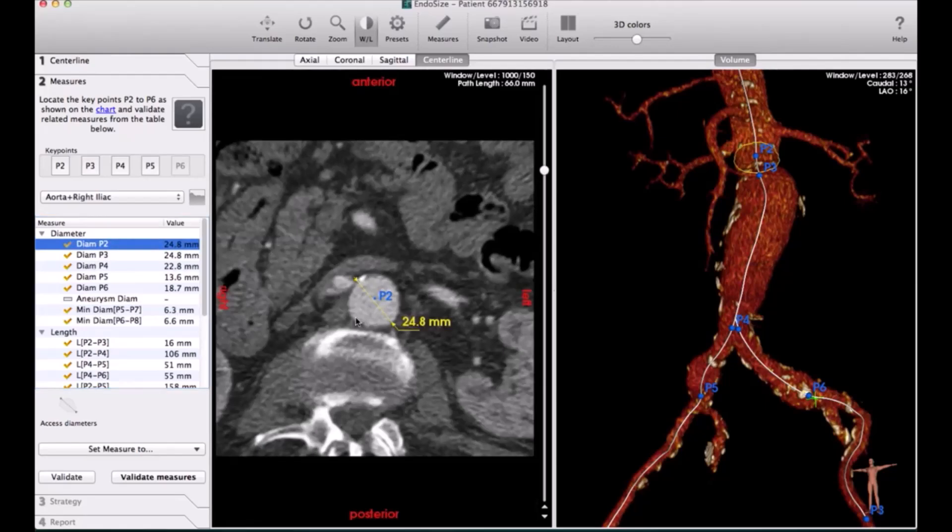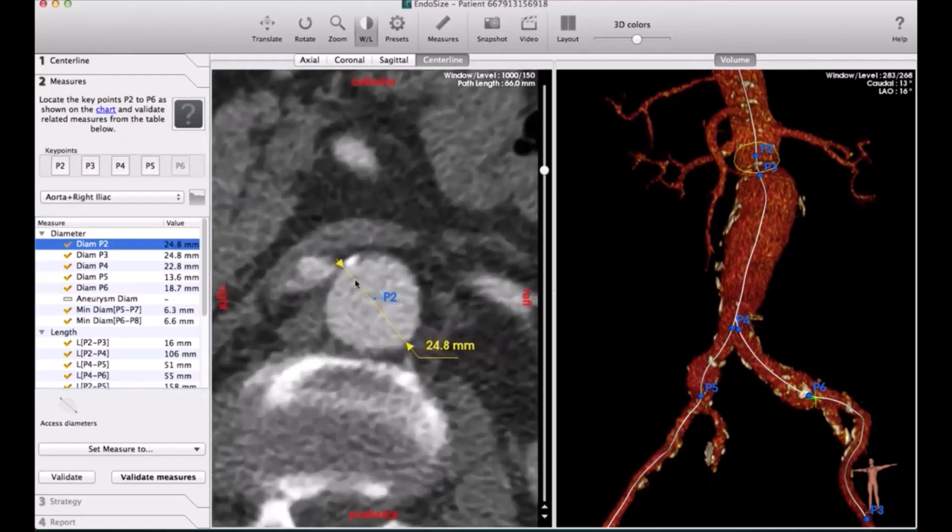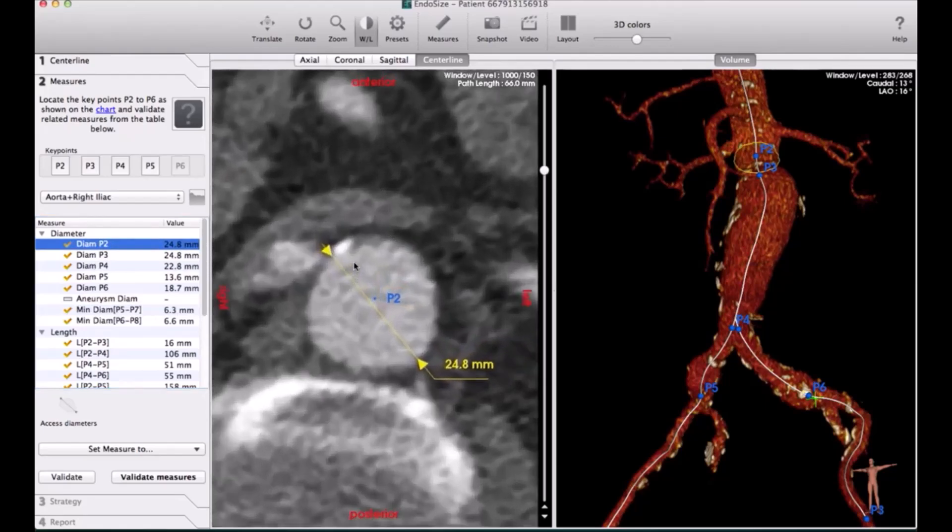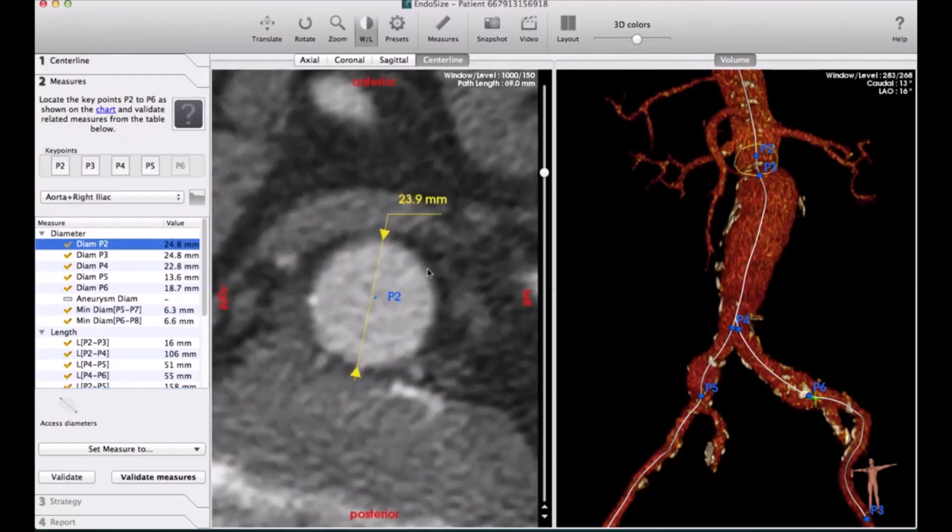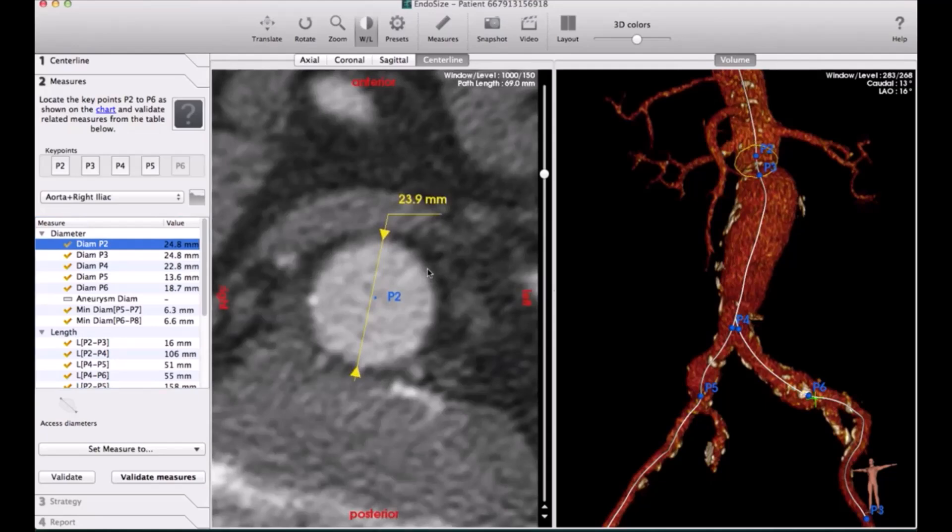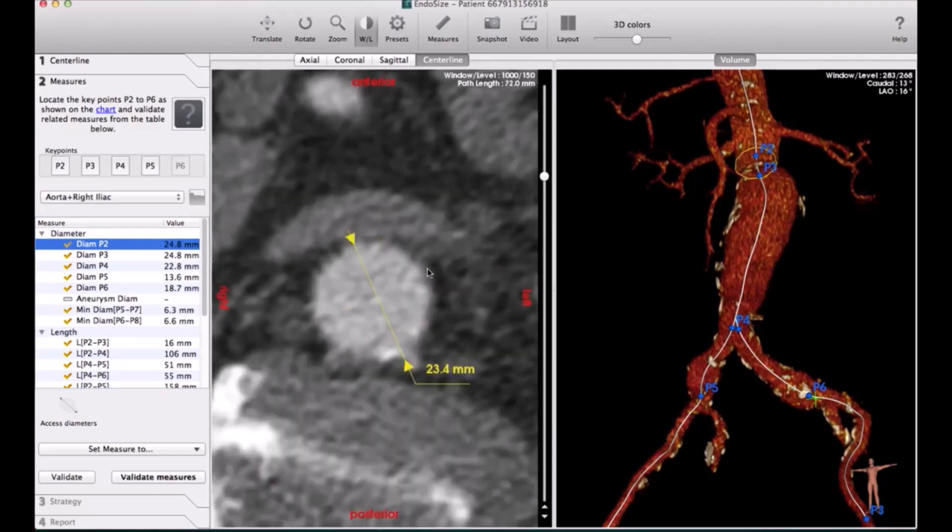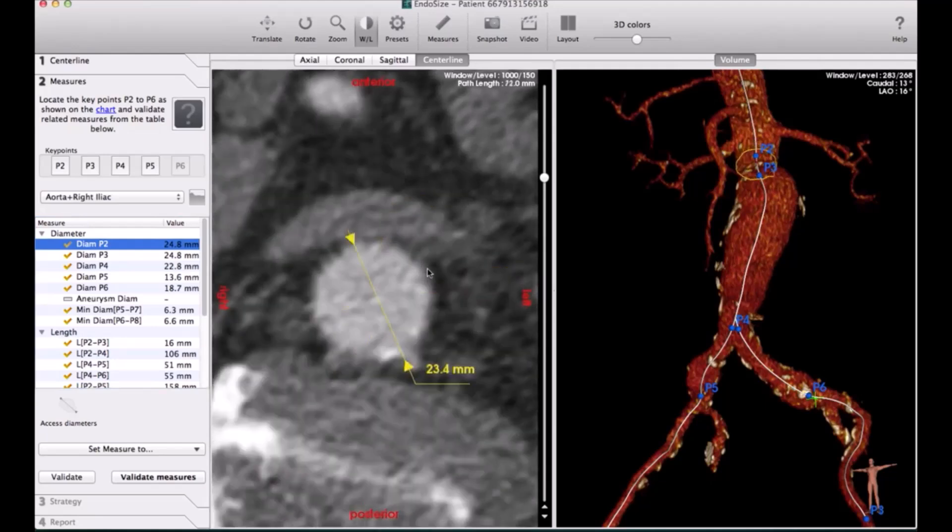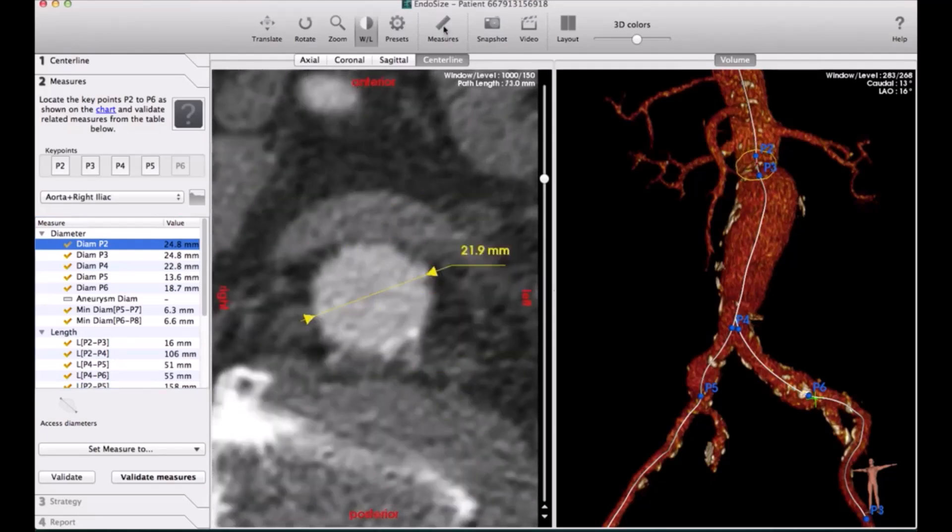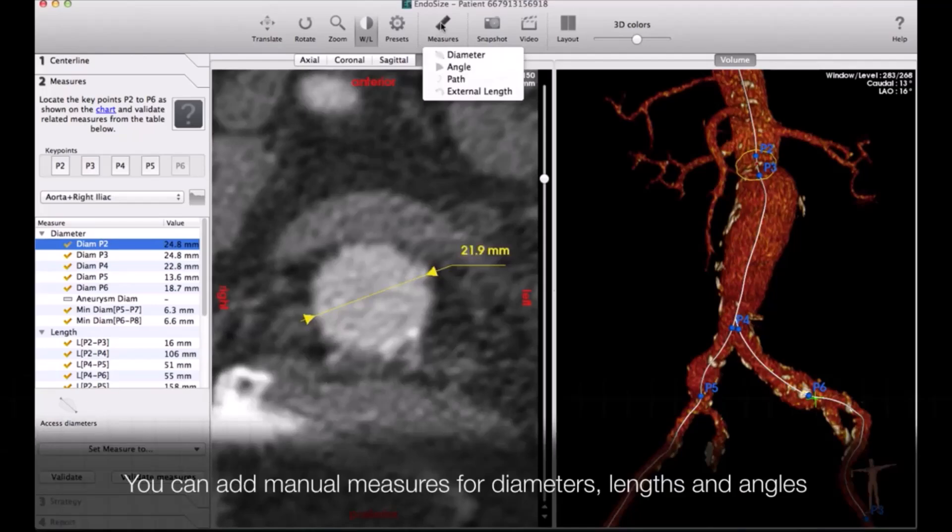So you get a report. Not only this, but if you decide that you are going to use, for example, Medtronic or Cook, it will tell you what is the reference number of this device and get you the contact number of the country in your region.